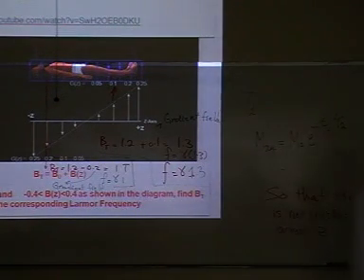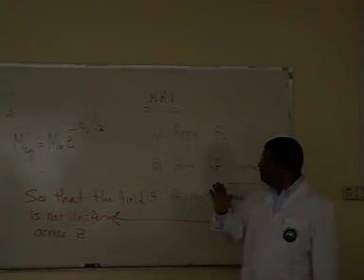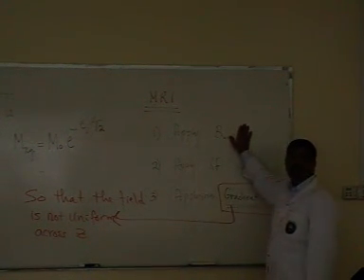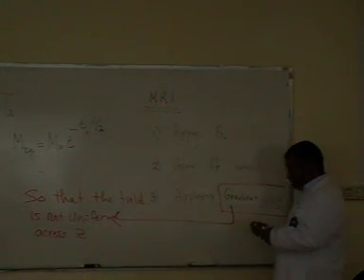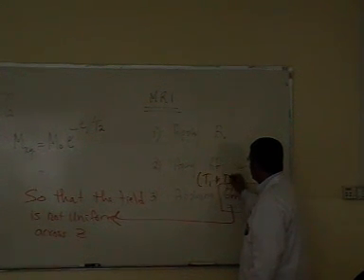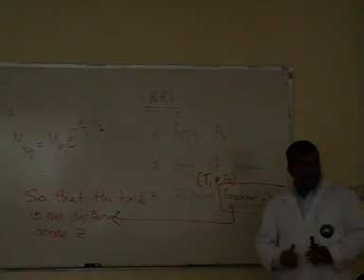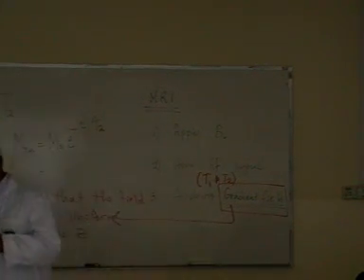Is that clear? These are very important components of the MRI system. The first one is the B0. The second part is applying the RF signal, which gives me the T1 and T2 times, the relaxation times. And then applying the gradient field, which gives me the non-uniformity, so the field is not uniform anymore. Any questions? Let's make sure that we understand these.